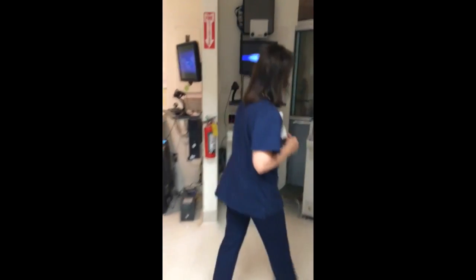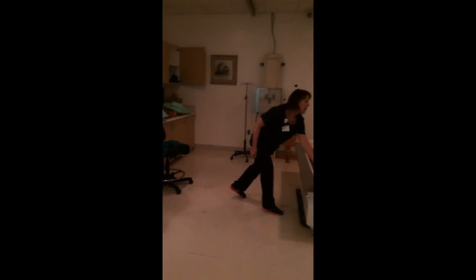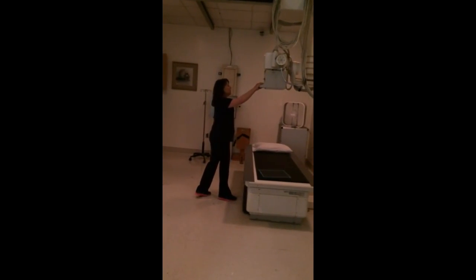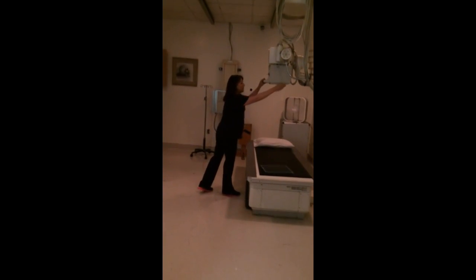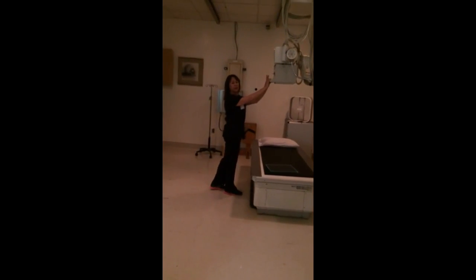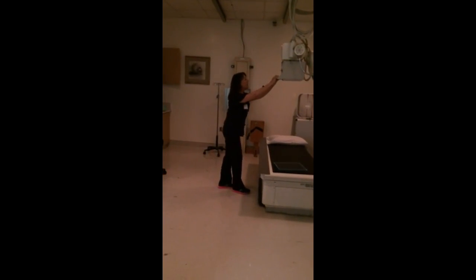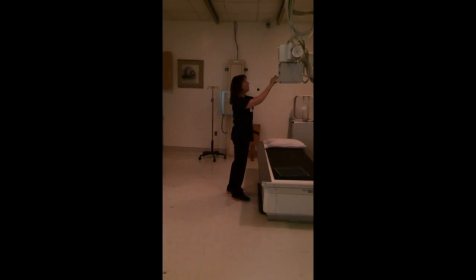So the first thing I'm going to do is set up my room. I'm going to detent my tube. And I'm going to measure 40 inches for my SID. And as we're here, since I know the distance of my patient's ASIS to the table, I'm going to angle my tube to 3 to 5 degrees cephalic.